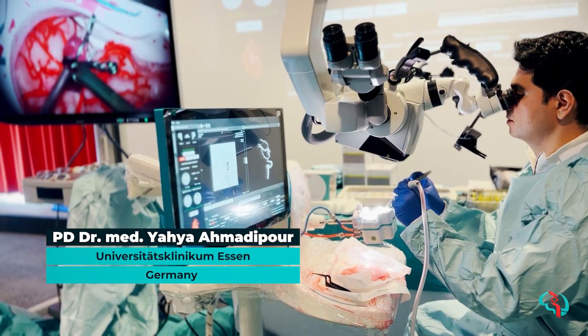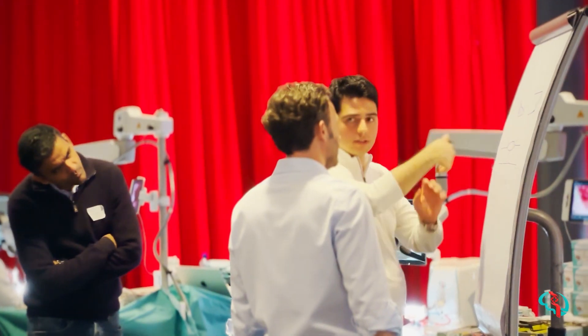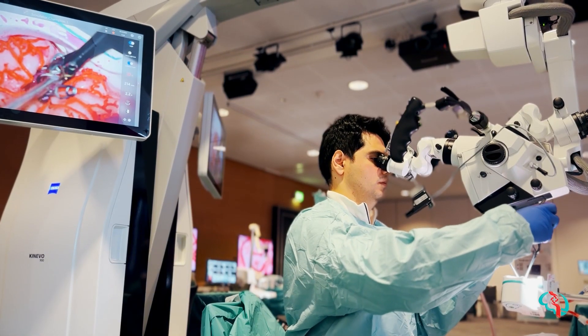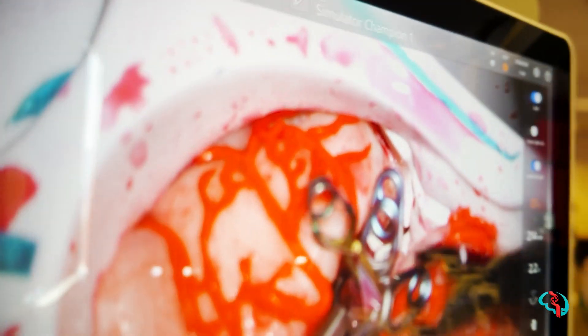It's good practice that we handle a rupture emergency situation and work as well. We have a model here with MCA aneurysms — it's a more difficult one with four vessels coming out, and we have ruptures.